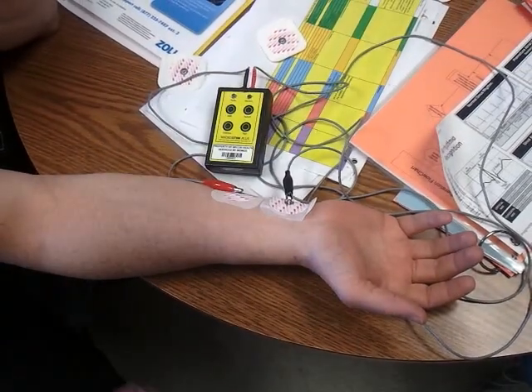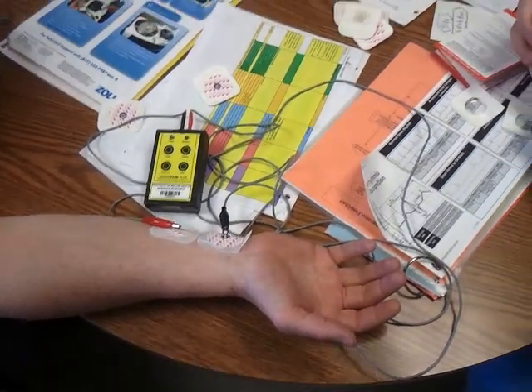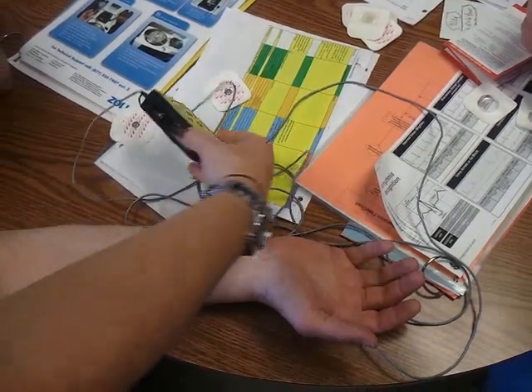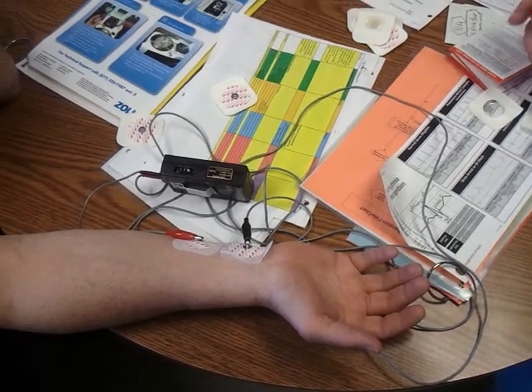Alright. So that means when we test his level of sedation or level of paralytics, we want to always use it at that level five. So chart that in the computer. Level five is what we get the four twitches at.